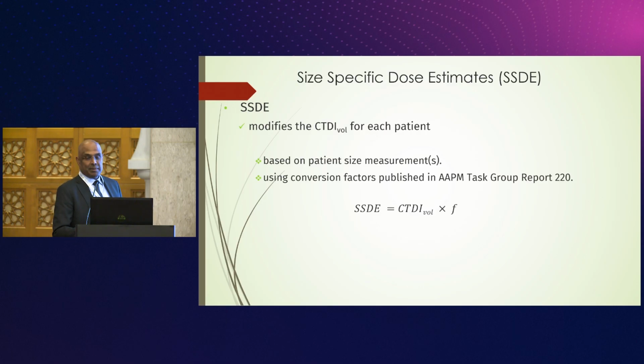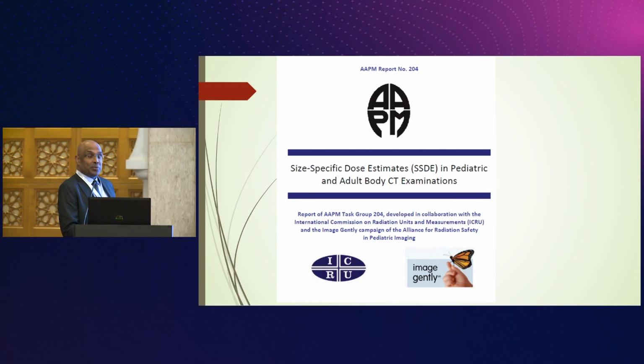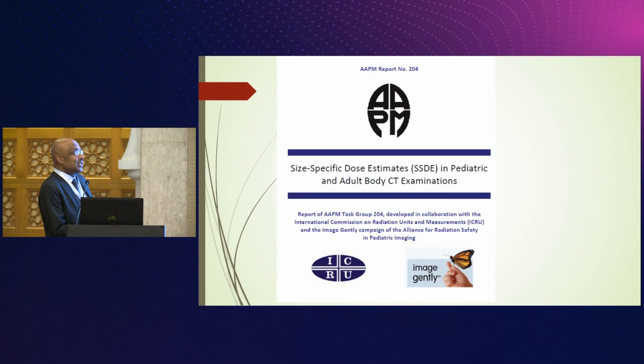The AAPM has published 3 publications. Report 204 tells you how we can estimate size-specific dose estimates for pediatric and adult body examinations.